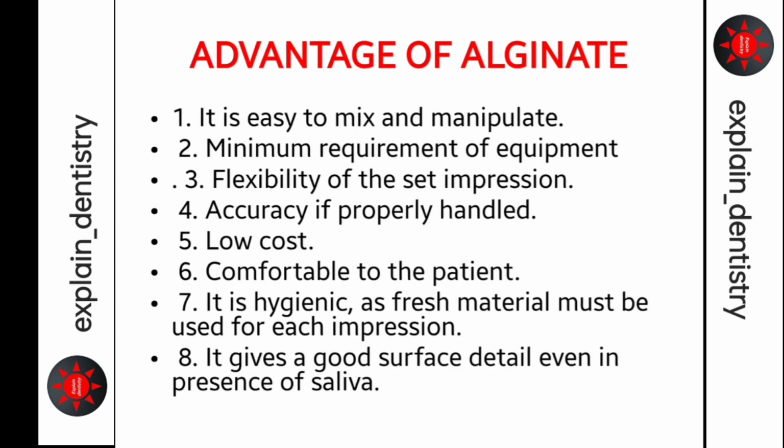Advantages of alginate. It is easy to mix and manipulate. Minimum requirement of equipment. Flexibility of the set impression. Accuracy if properly handled. Low cost, comfortable to the patient. It is hygienic as fresh material must be used for each impression. It gives good surface detail even in the presence of saliva.